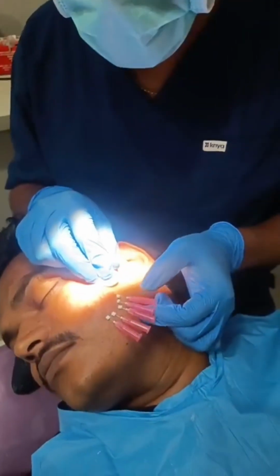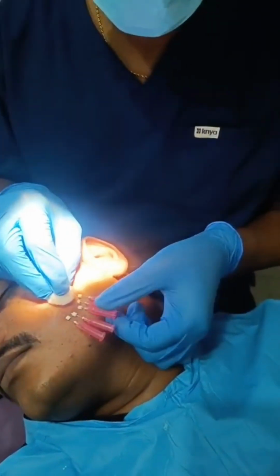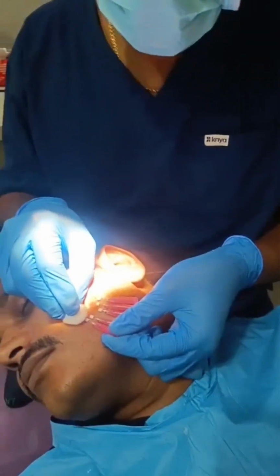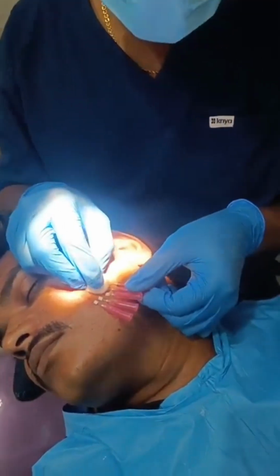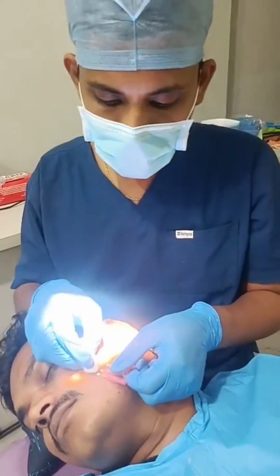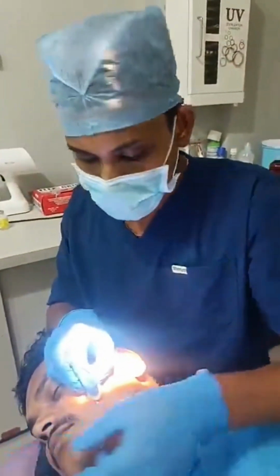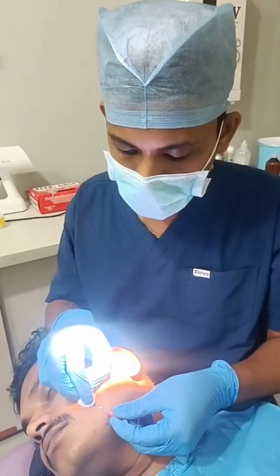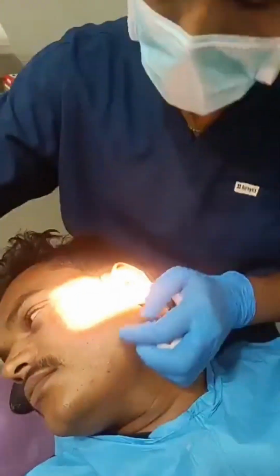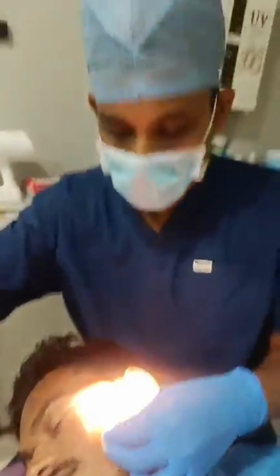So we have done with this side, and then we'll do the other side. Here also only one small thread has popped out, so I am cutting it off. That's it.